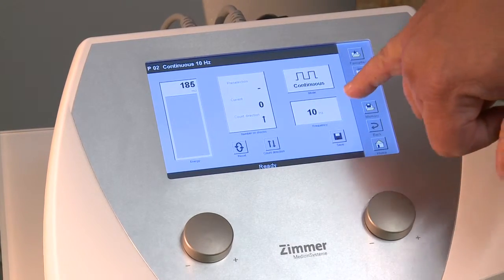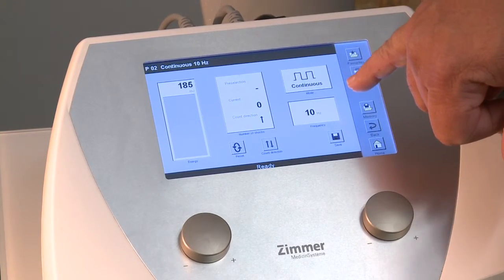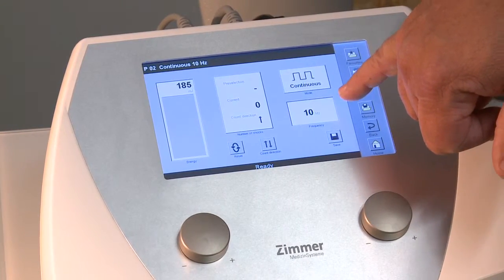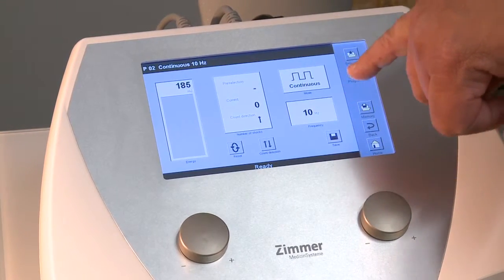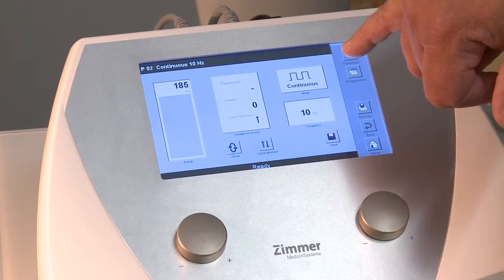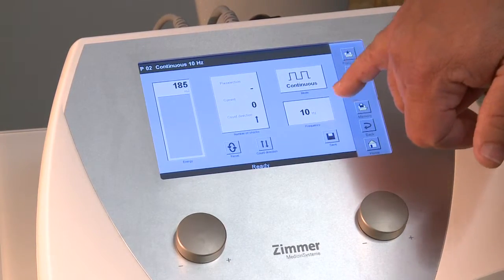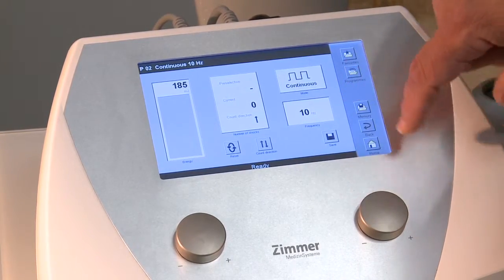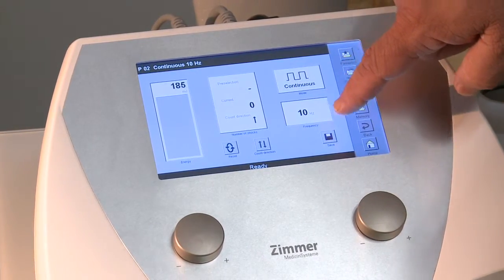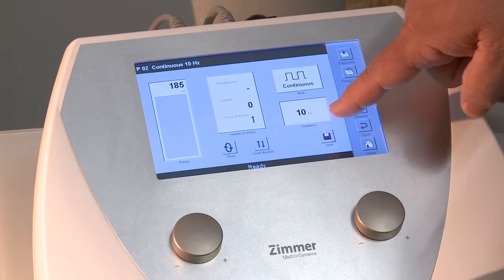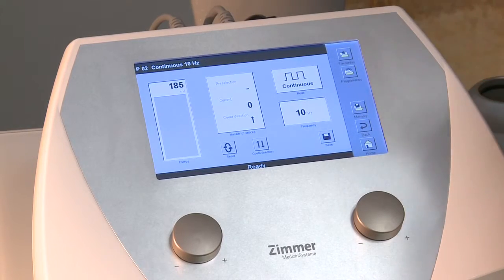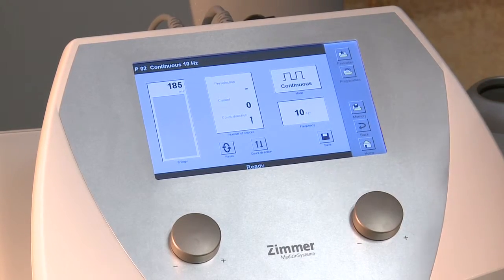The third and final setting is your frequency — how many pulses per second you deliver into the body tissue. Basically, 10 Hertz means 10 pulses per second.